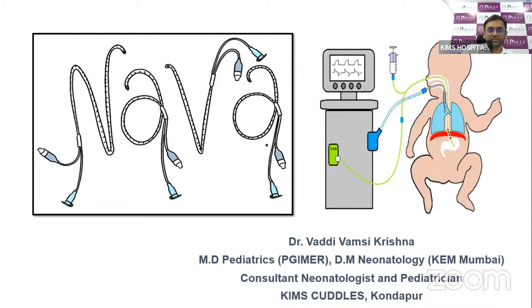Good afternoon, everyone. Today we'll discuss a newer mode of ventilation, that is NAVA. This is the newer mode that is getting popular nowadays. However, the majority of ventilators don't have this kind of mode. Only the Getinge Maquet Servo-N and Servo-I have the NAVA facilities, which need a special module to be inserted. We thank Getinge Maquet for helping us to understand NAVA ventilation.